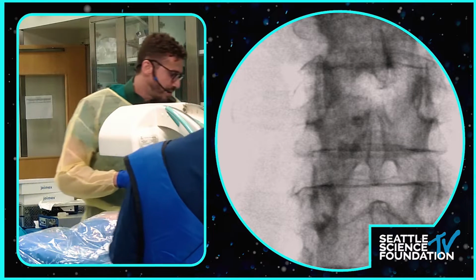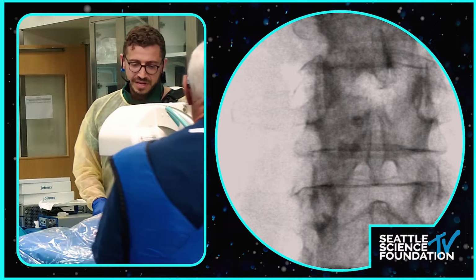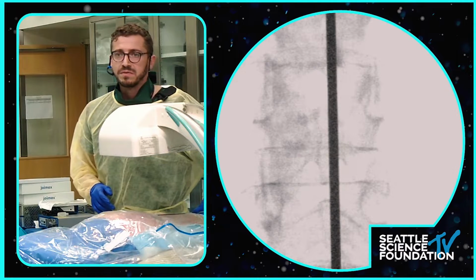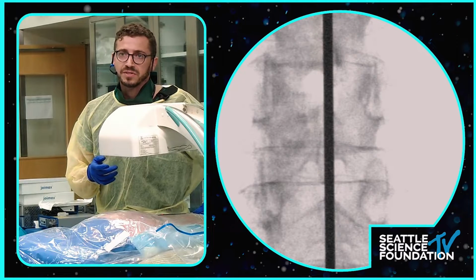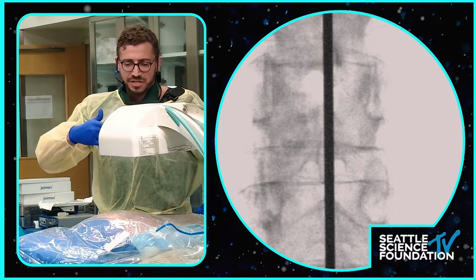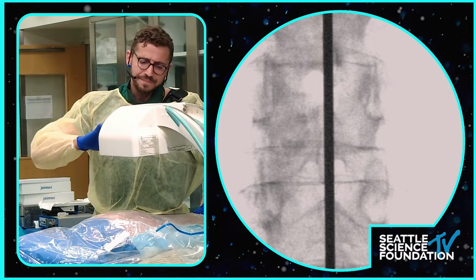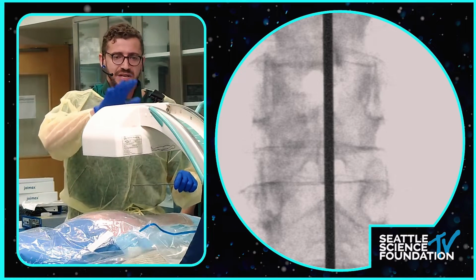The first thing you want to do is figure out your midline. We already did that earlier, so if you could take a shot here, please. Another shot here, please. Okay, that's a perfect midline shot. You want to make sure you mobilize the patient. You do want to wag the patient to make it a perfect AP. Don't change the X-ray at all.